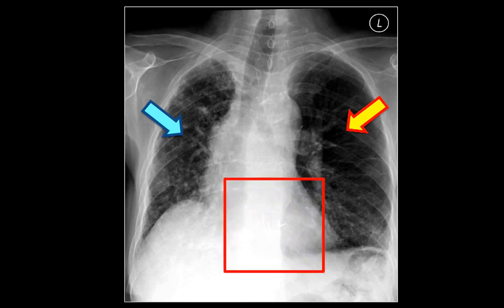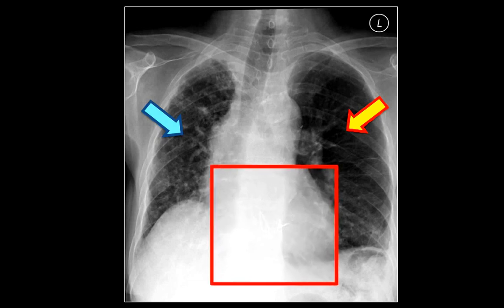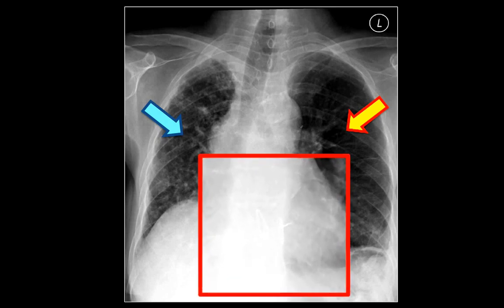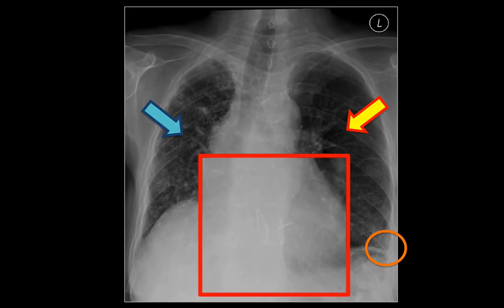What's very unusual about this case is the sternotomy wires. If we enlarge this, you're going to notice that the sternotomy wires have a vertical orientation instead of the usual horizontal orientation that we're used to after CABG cases. Another thing you might have noticed is the presence of a blunted left costophrenic angle. This may represent blunting from pleural effusion; however, in this case the blunting is related to pleural thickening secondary to previous surgery.